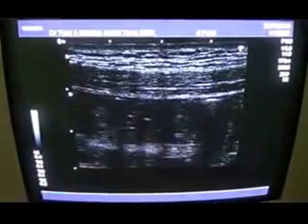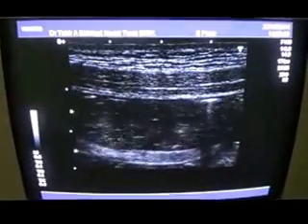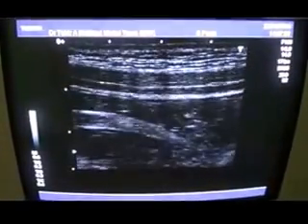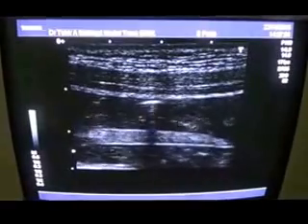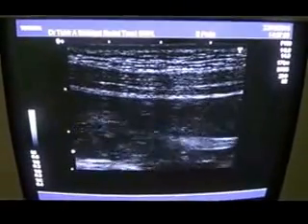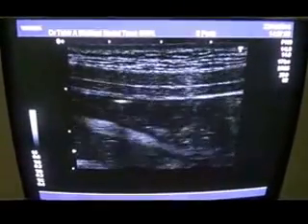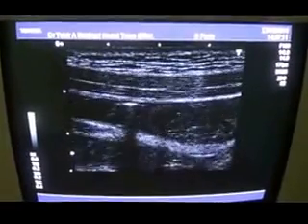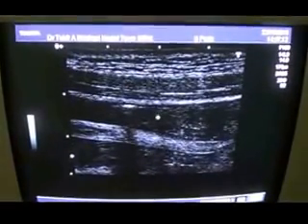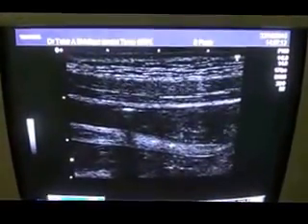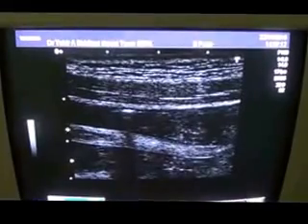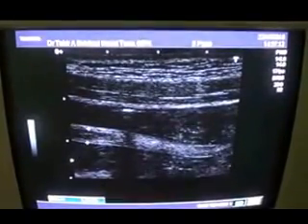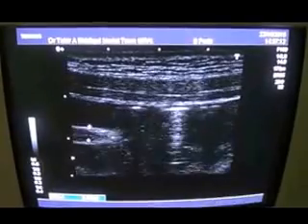Let me magnify a bit. You can see this bright echogenic area — this linear echogenic area — measuring approximately 3.5 mm in depth.